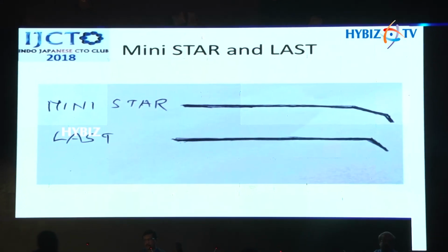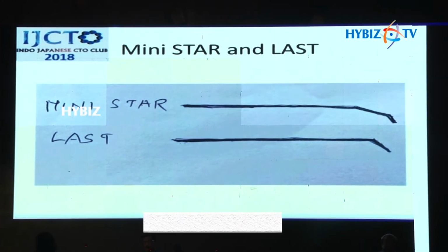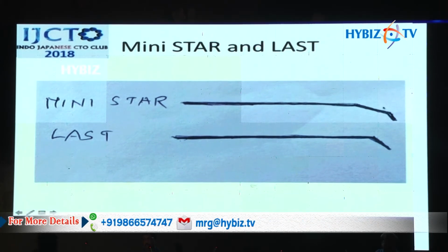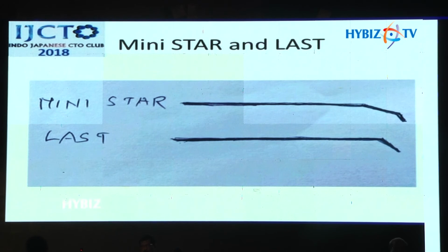Now, mini star and LAST, the basic principle is to limit the dissection to the maximum possible extent, and just try to enter the lumen just after the body of the CTO. Mini star basically uses Fielder XT wires, softer gentle curves and small knuckles which are just pushed, not very aggressively, and just try to enter the distal lumen. In limited antegrade subintimal tracking, almost a 90-degree or near 90-degree angle is made with a Confianza Pro, and one tries to puncture into the lumen of the vessel just after the CTO body.